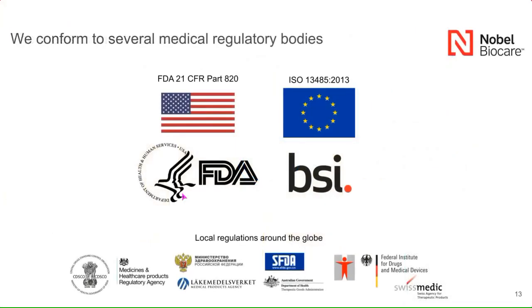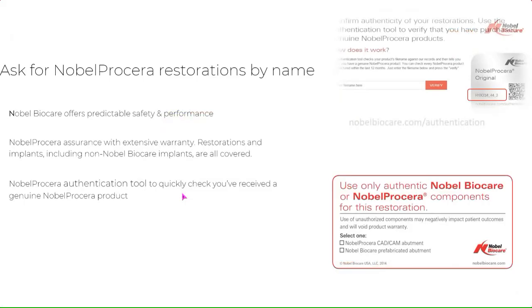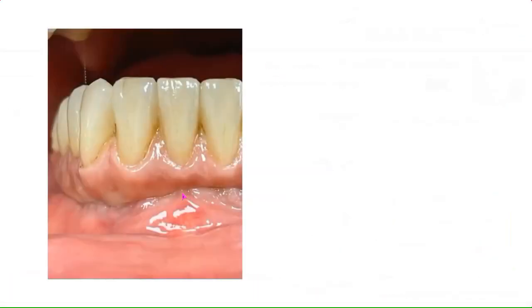Of course, all of our NobelProcera implant bridges and all of our NobelProcera products are certified medical devices. So we adhere to all the regulatory bodies across the world. Of course, the FDA being very important for us here, and the BSI. But we're always regularly audited through these organizations, and we do generally pass very, very high within that as well. You can always check the authenticity of any of your NobelProcera restorations right on our website. The restoration will come with a sticker, and you'll have a file number there. You can just pop that in, and you'll be able to verify that it is an authentic NobelProcera product.